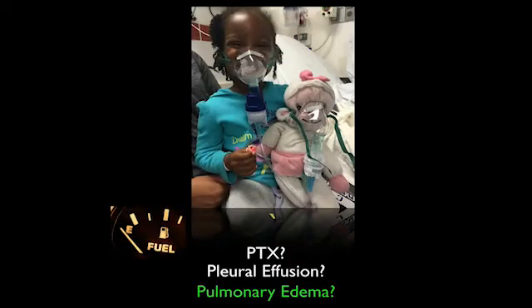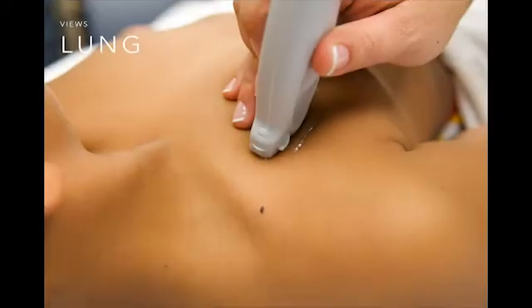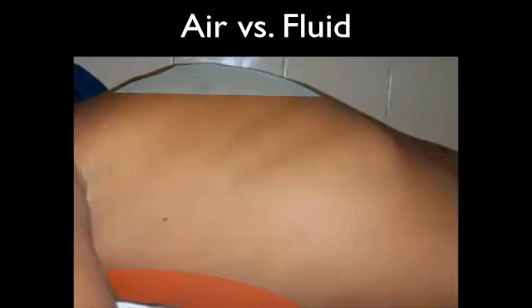Lastly, we have our P in HiMAP, and this was traditionally for pneumothorax, but it's also for pleural effusion and pulmonary edema. So you can get a lot of information for this study. I mentioned the phased array probe, but you can switch over to the linear probe. I personally like the linear probe better, especially if you're looking for a pneumothorax. You have a lot more detail of that pleural line. And in a lot of the machines these days, you can actually just push a button and it easily switches over. So you're not really wasting any time.